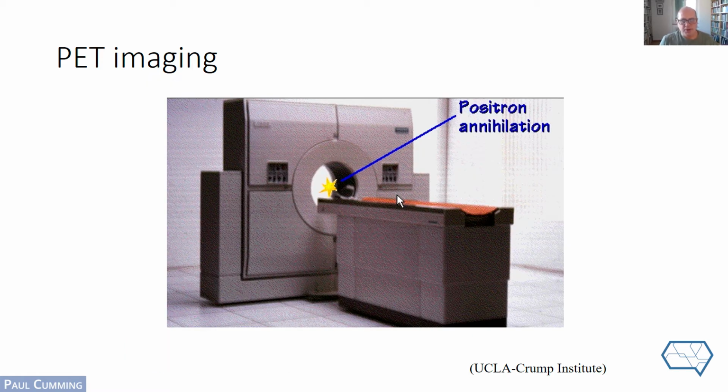And that positron annihilation here taking place inside the gantry of a relatively recent PET scanner, the one that they were using at UCLA about 15 years ago. That event takes place in, imagine the patient or the volunteer lying in the scanner with their head in the hidden rings. Notice that modern scanners hide the wires nicely. That's a little bit of a joke, but inside that scanner, there are thousands of wires connecting all of the different detectors hidden inside the nice white chassis of the medical instrument.